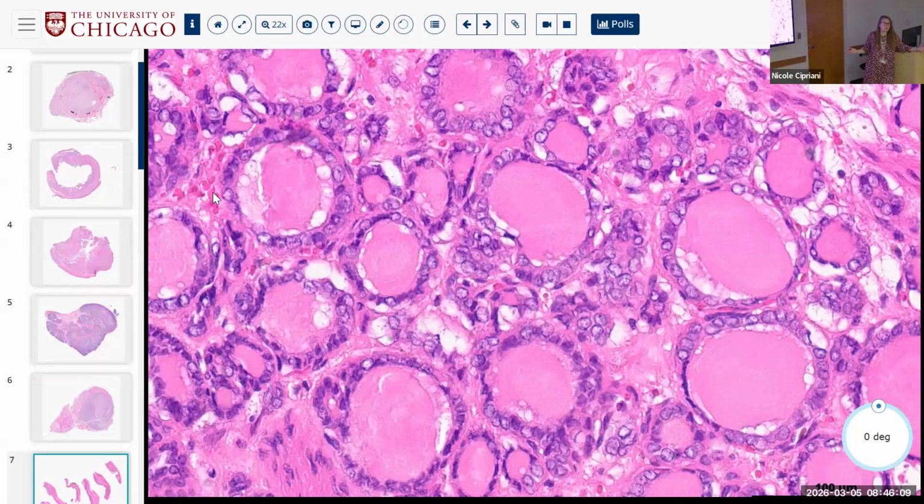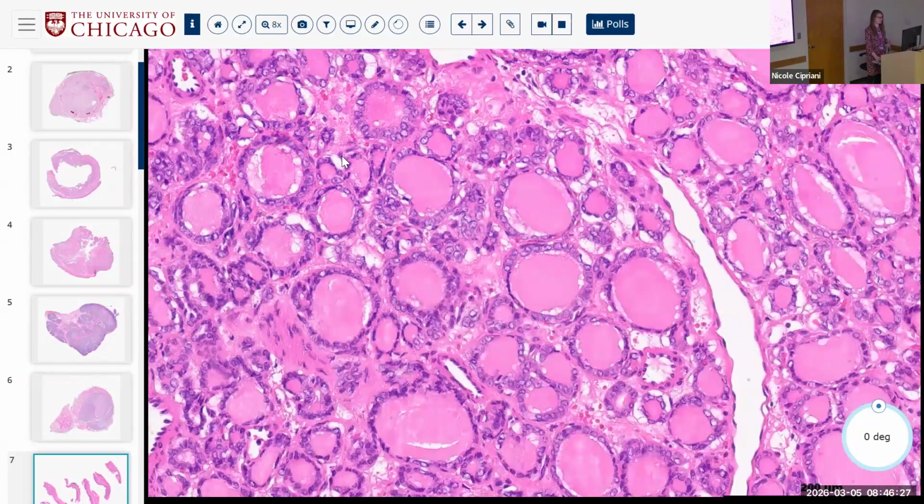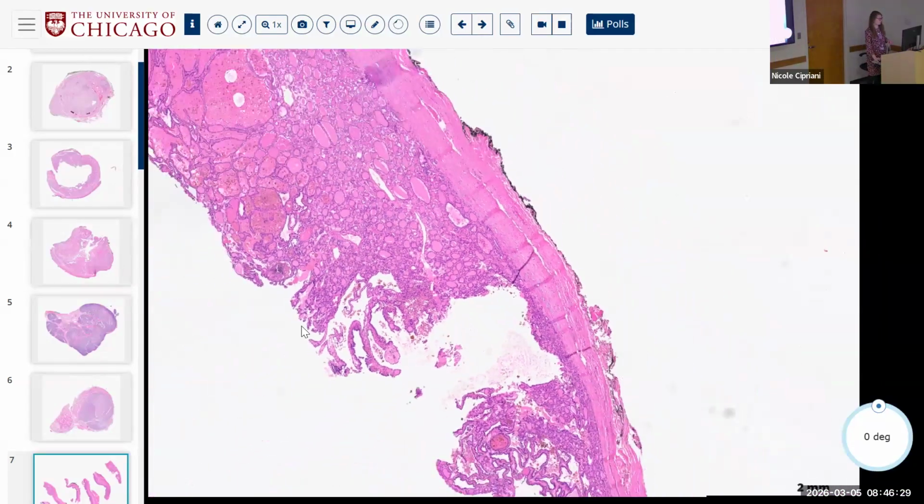It already had a known BRAF V600E from the FNA. It is PTC. You cannot have BRAF V600E and not be PTC. You can have BRAF V600E in a completely follicular pattern, circumscribed and basically encapsulated tumor. These are rare, but they exist.